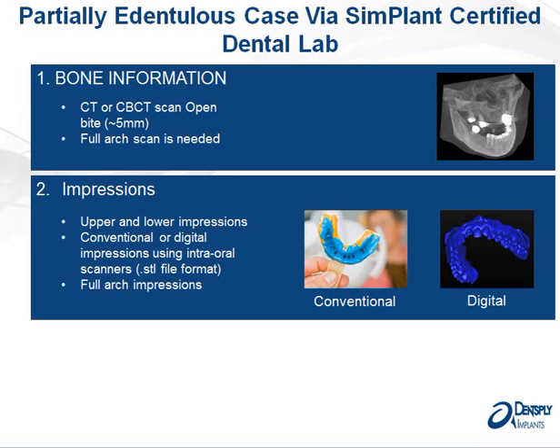Now, as for the impressions, it is extremely important to use a silicone-based impression material if the model is not going to be poured up immediately. Now, you can use alginate, however, the model needs to be poured up immediately, obviously, because we want to prevent any inaccuracies being introduced inside the model. Just like a crown that doesn't fit well because of a bad impression, a surgical guide will not fit correctly if the impression is incorrect or has been degraded.